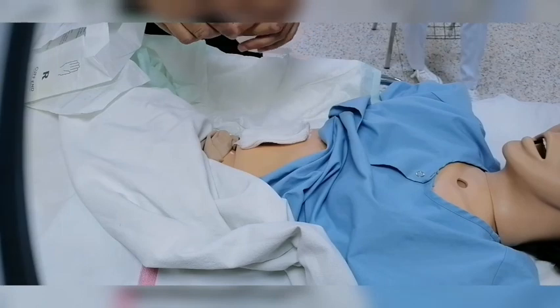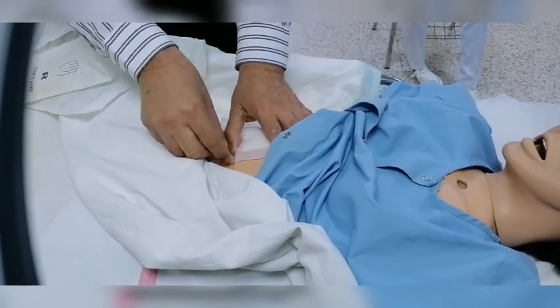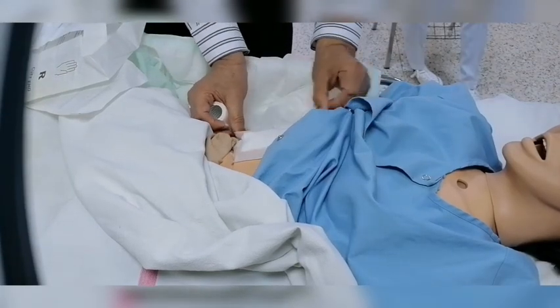So we cut a piece of plaster to suit the size of the dressing, and we will apply it.